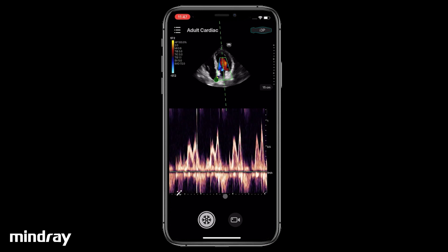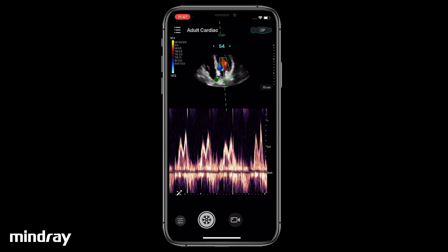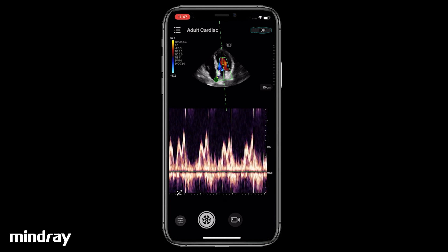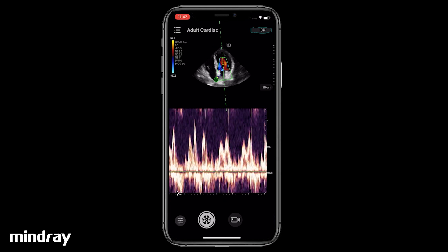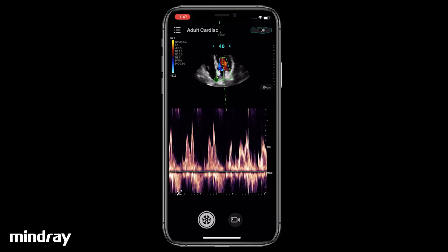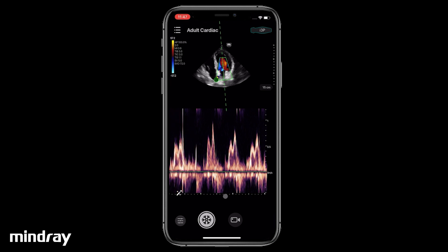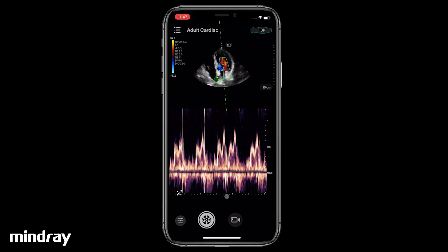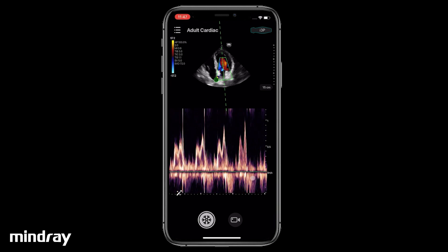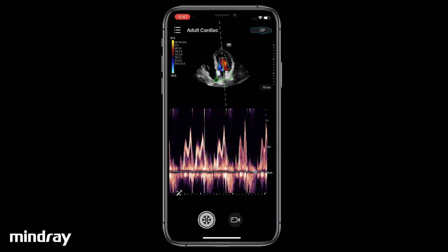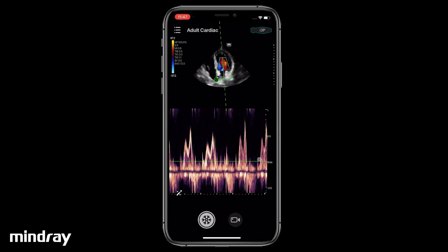Swipe left and right in the spectral region to change the PW gain. Swipe up and down in the spectral region to change the baseline.